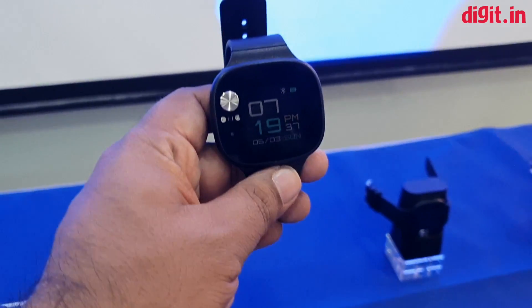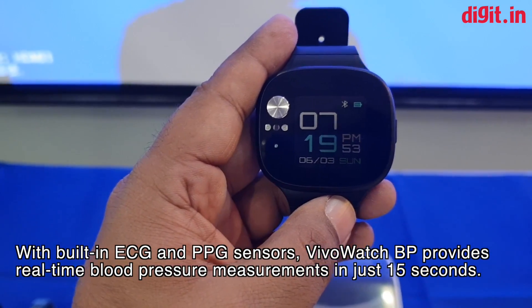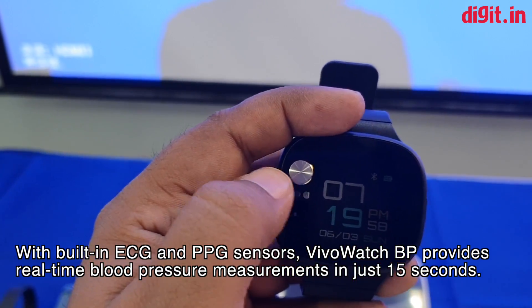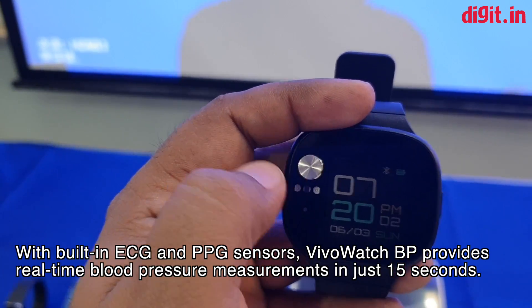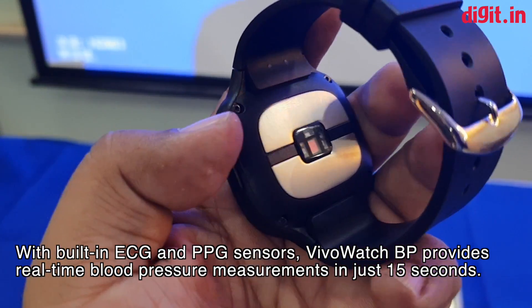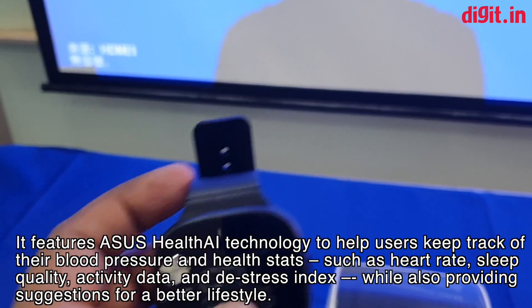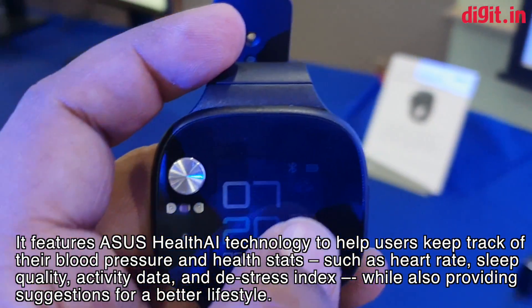This is the Asus VivoWatch BP. The idea is that with this watch you're going to be able to tell what your blood pressure is like. How is it going to take those readings? Well, there's an ECG meter right here. This is going to record your ECG, there's a PPG sensor here and also a PPG sensor at the back. So it's going to take dual PPG sensor-based readings and an ECG reading to basically measure what your blood pressure is like at any given time.